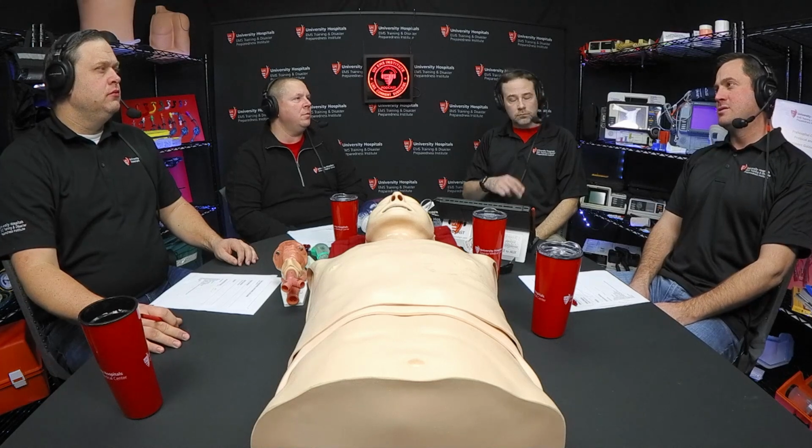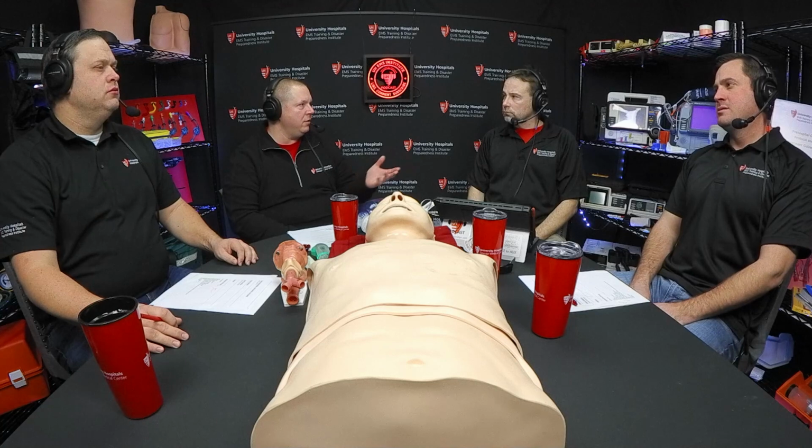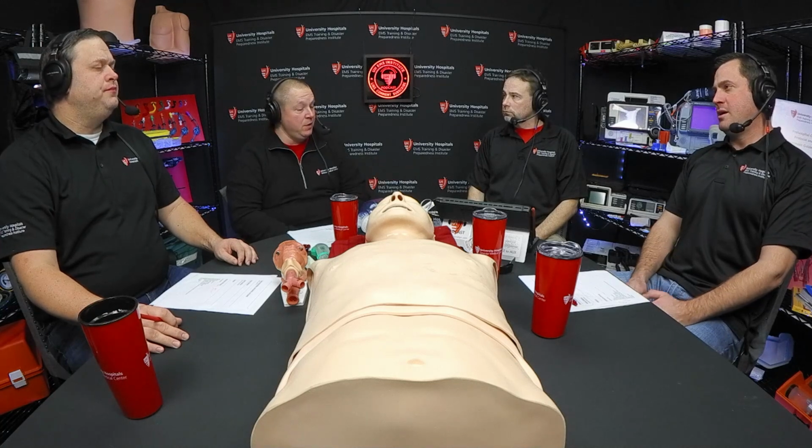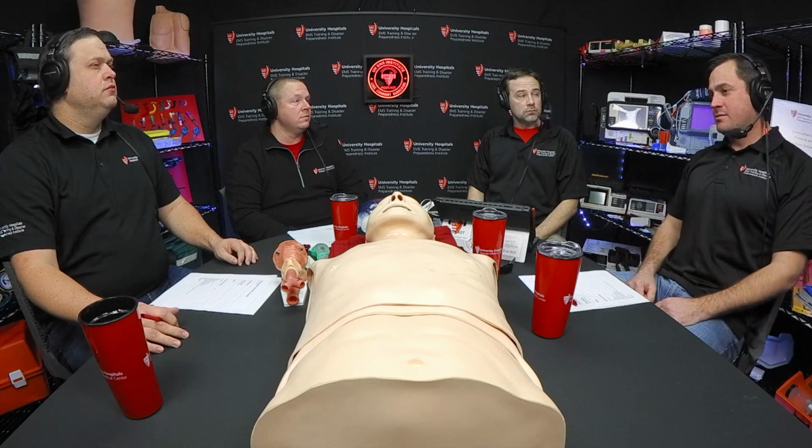I think it drives home the point and solidifies what we're talking about with your PEEP valve and how it should be included in a BVM, and how much the lungs actually inflate when you're doing proper ventilation.